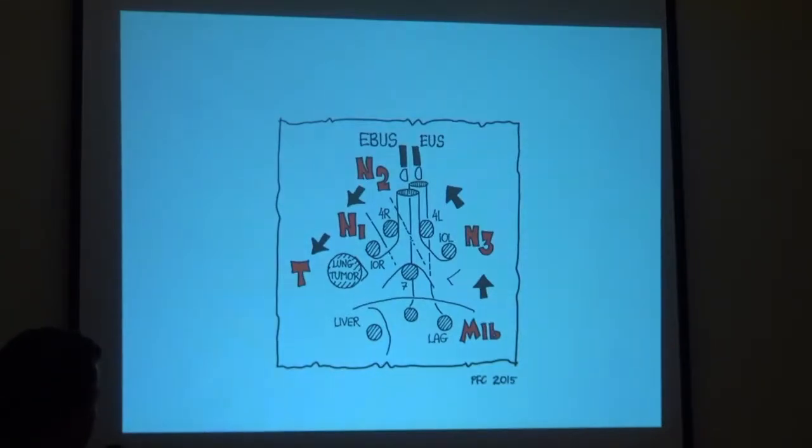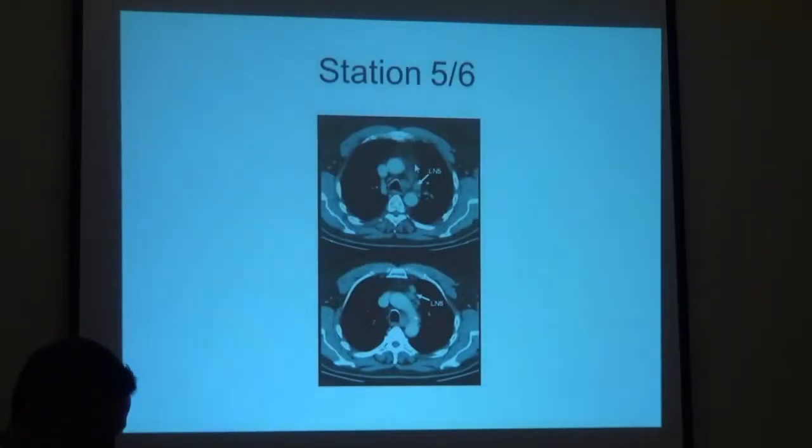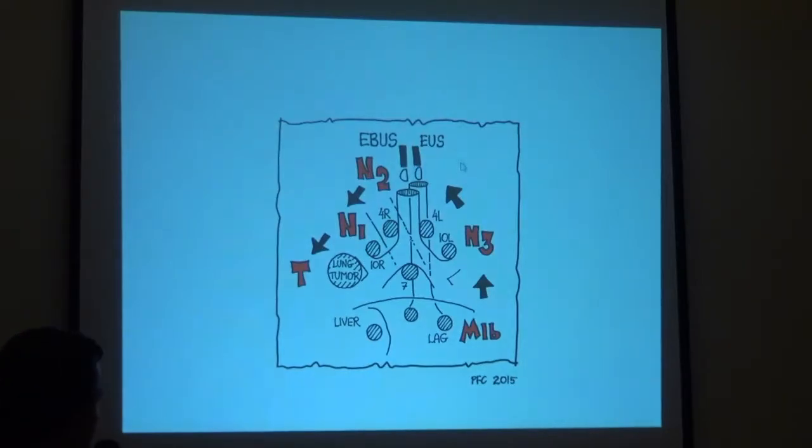Dr. Ashraf already mentioned the importance of the sequence of the staging. So if you want to do your staging, you want to go to the highest stage first, now that you know your landmarks. If there's an adrenal lesion, you could use EUS. With EUS you get to the stomach, and from the stomach you can mostly see the left adrenal, sometimes the right. There's a case report of EBUS actually reaching. The EBUS is shorter, so it can get to the stomach, and sometimes you can't see the adrenal well. So you go for this one first with M1.